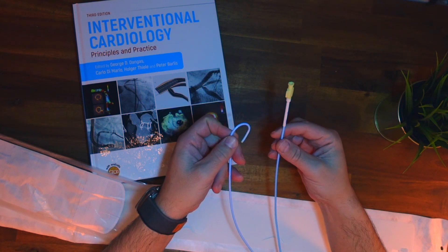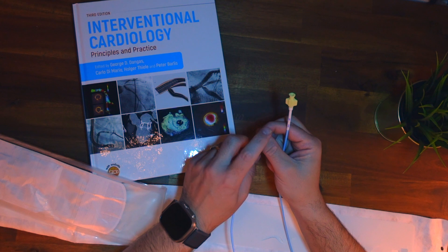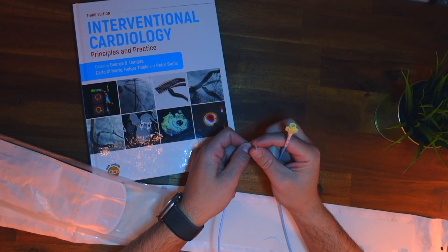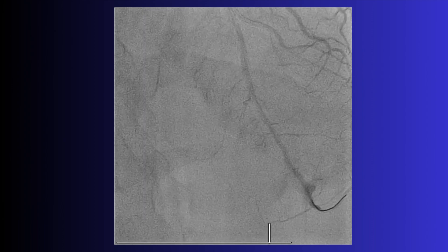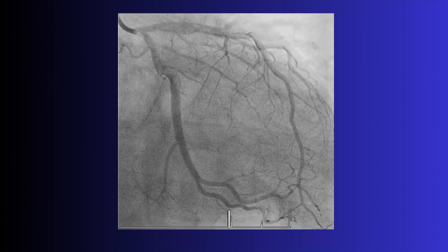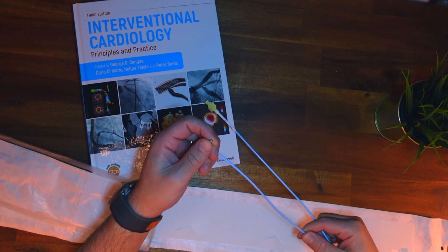You can see the shape — different catheters have different shapes and these catheters are pre-shaped to allow us to access the coronary arteries. This particular shape is one that we place into the left coronary artery, so it curves around the bottom part of the aorta, and that bit of the tip passes into the artery. Through there is where we inject our dye to do the angiogram, and we also introduce our equipment.